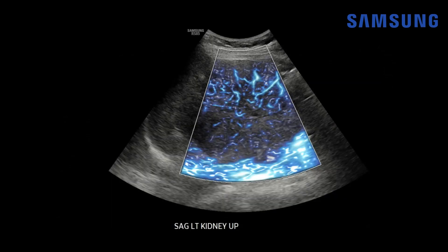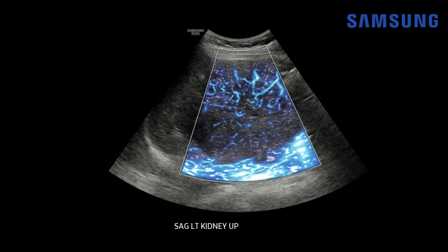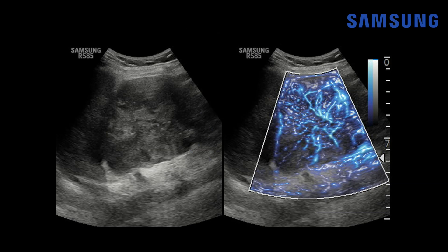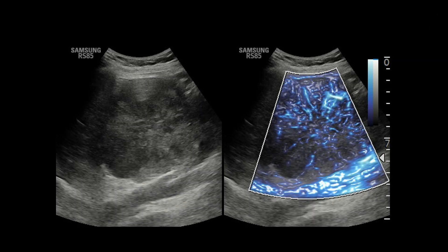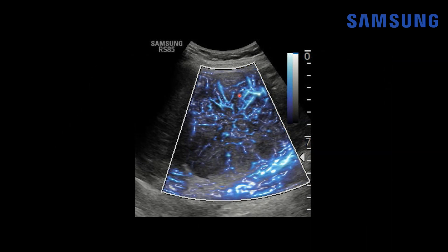The internal vascularity of the mass is even more evident when we use microvascular flow imaging, a technique that detects slow flow within small caliber vessels — ideal for detecting intratumoral vascularity. On these images, you can see that spokewheel configuration of vascularity even more strikingly than with color Doppler, because this technique is more sensitive to detect flow.